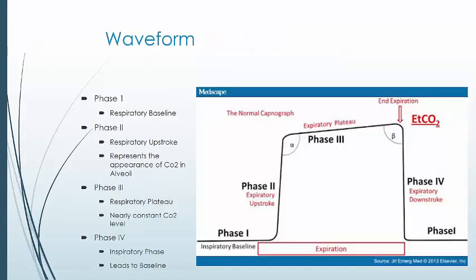When you look at the waveform, it's important to note, Bob Page has some awesome information out there about capnography. If you're ever inclined to look him up, he's got some good books and everything. He once said that an end-tidal CO2 value without a waveform is like a heart rate without an EKG. In other words, it tells you some information, but it only gives you a small percentage of the picture. So you need to understand what you're looking at and what each part is in order to analyze a proper capnography waveform.